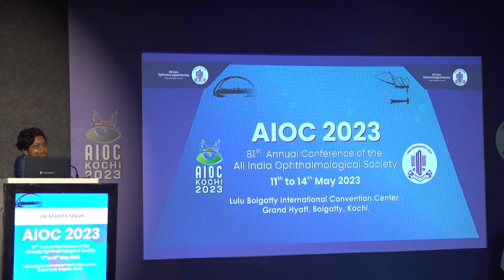In patients with dry eye, sometimes it's difficult to do the Schirmer test or tear break-up time on the slit lamp. So these patients can go for non-invasive testing as well as topography at the same time. And sometimes dry eye patients usually give very fallacious results on topography. So it is better to put one drop of lubricant and then go for it.